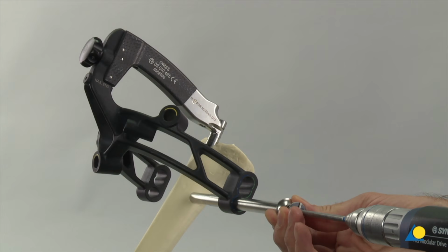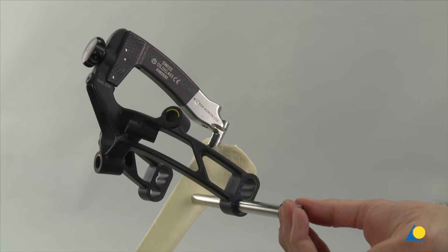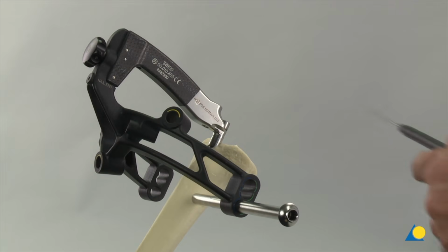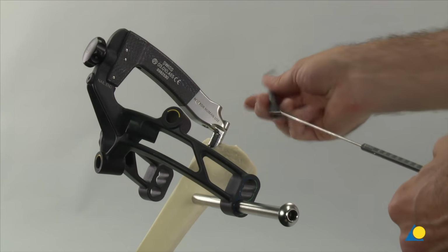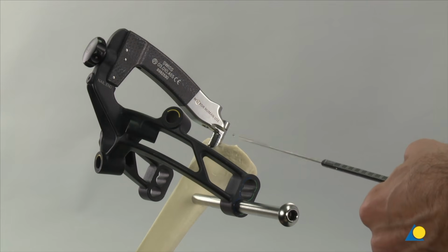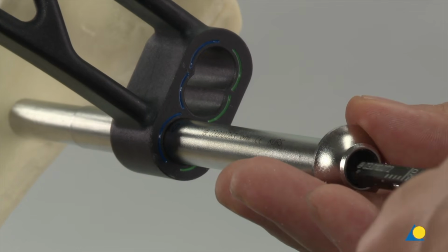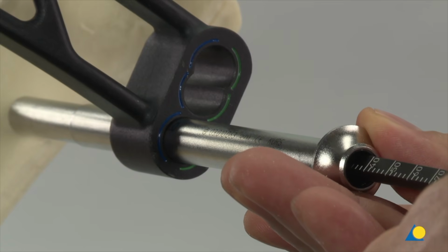The position of the drill bit is confirmed with image intensification. The drill bit is withdrawn and the drill sleeve is removed. The depth gauge is disassembled into 2 parts, the outer sleeve and the measuring device with hook. While ensuring that the protection sleeve is pressed firmly to the bone, the measuring device is slid through it, making sure that the hook grasps the far cortex.